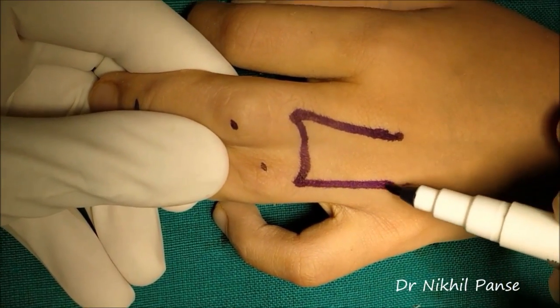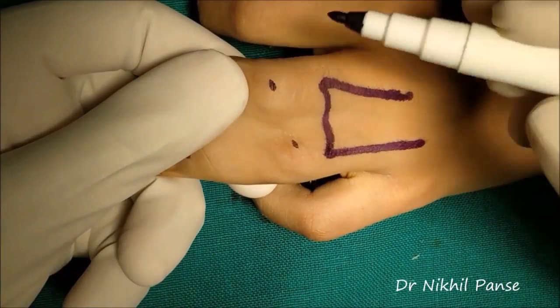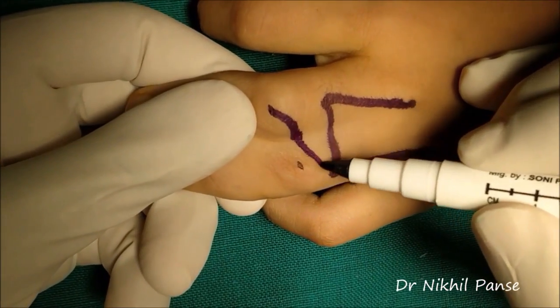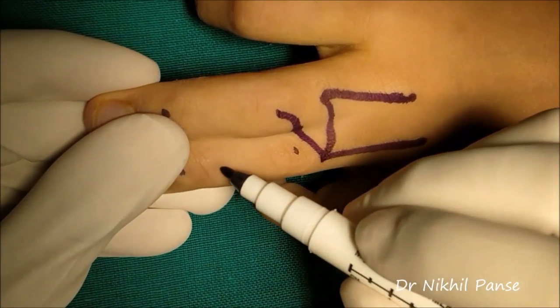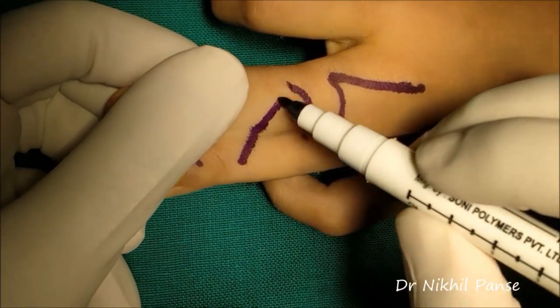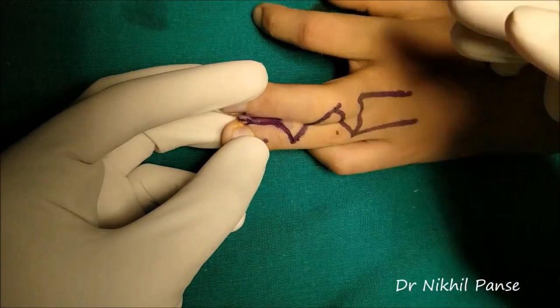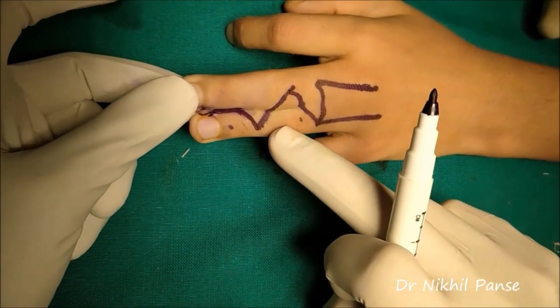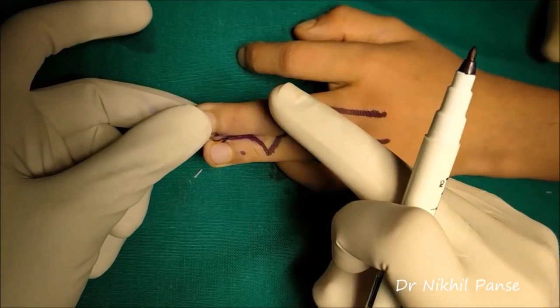Now the dorsal zigzag incision begins at the apex of the dorsal flap and extends in a crisscross manner till the tip of the finger. The palmar zigzag incision is designed in an opposite manner, like a mirror image to the dorsal zigzag incision.